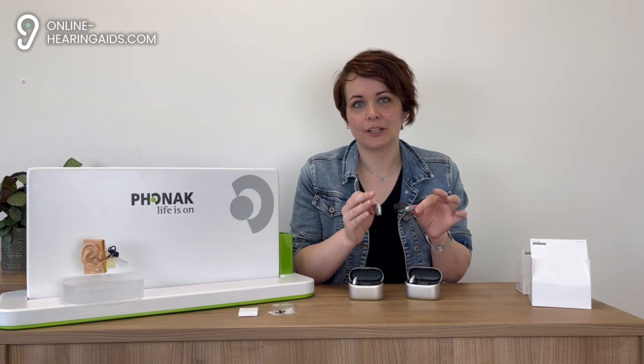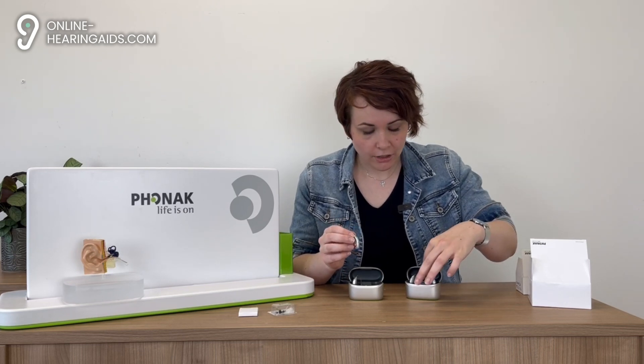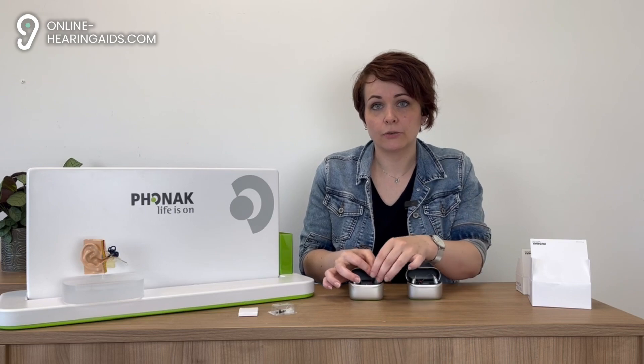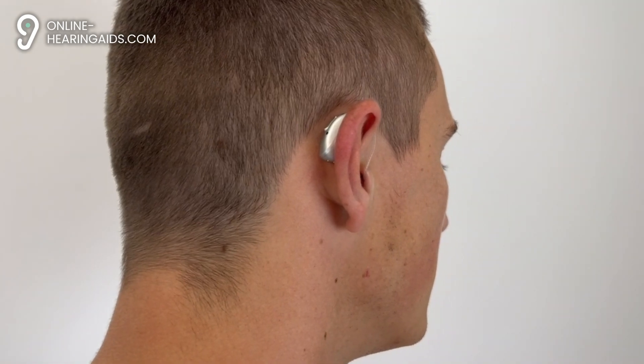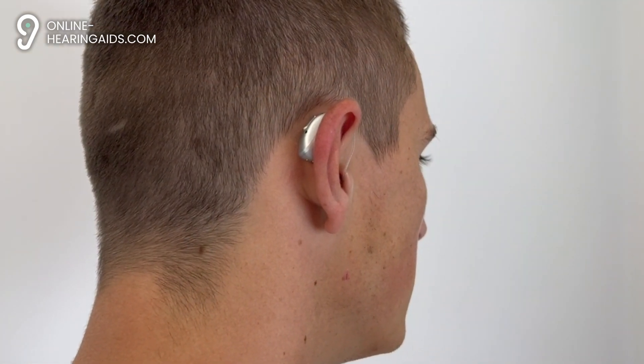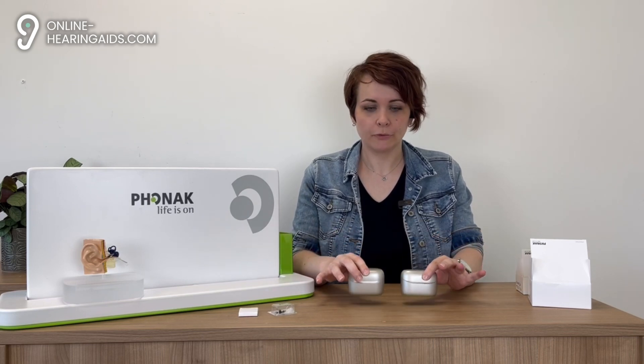The sound quality of these models is exactly as we expect from Phonak: outstanding. The sound is comfortable without any unpleasant sound tones. We tried them out here at the office and the sound is just absolutely perfect, both in silence and in noisy environments. Both hearing aids are rechargeable with their respective Phonak chargers, and they offer a user-friendly experience with tap control for hands-free calling for both iPhone and Android users.